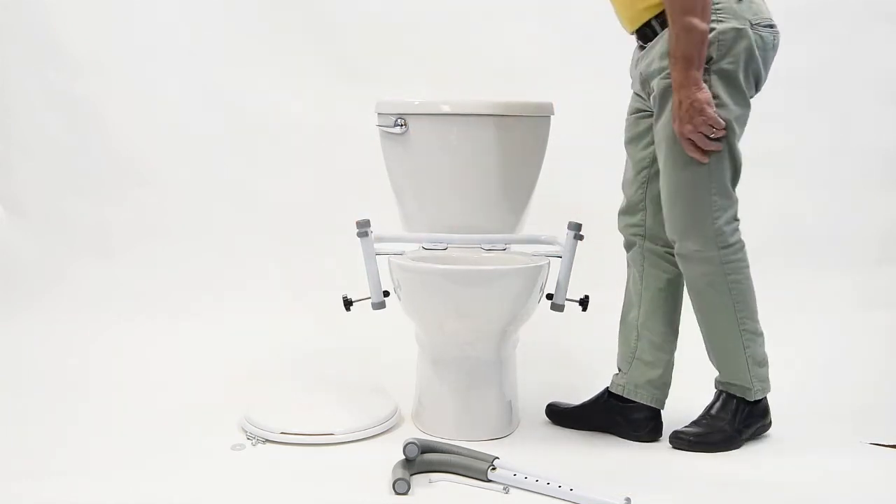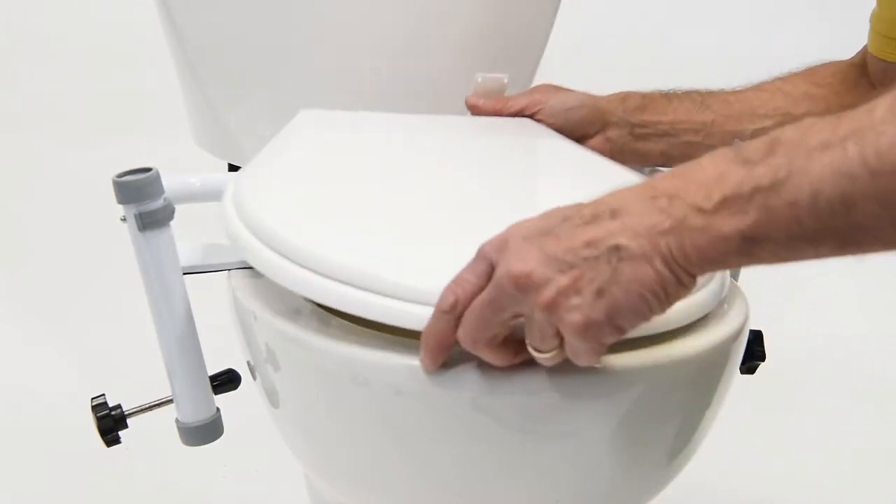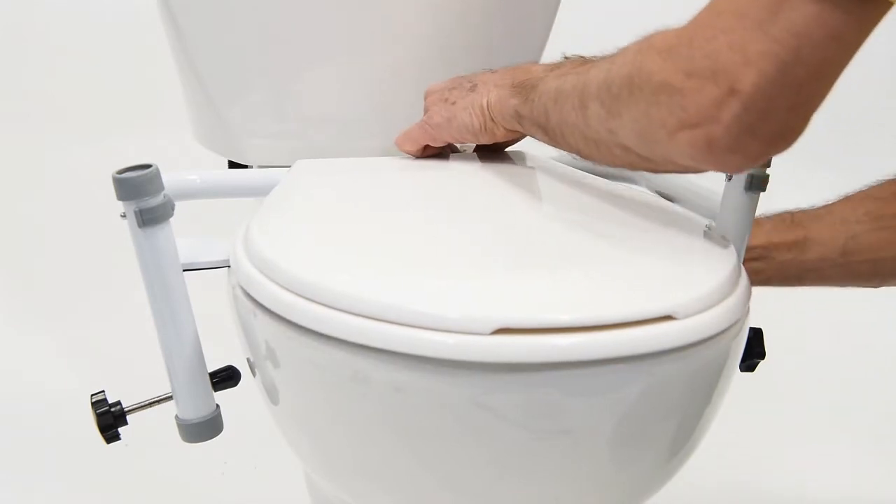Next, place your existing toilet seat back onto the bowl, aligning the attachment holes with the Ultra Frame base plate. Once in position, reinstall the toilet seat hardware.